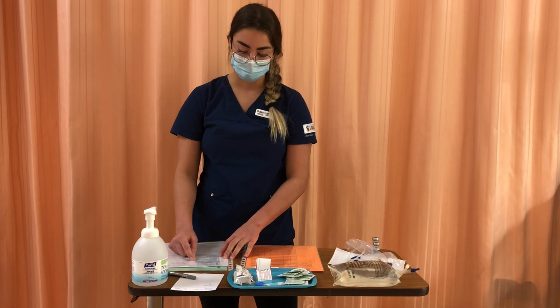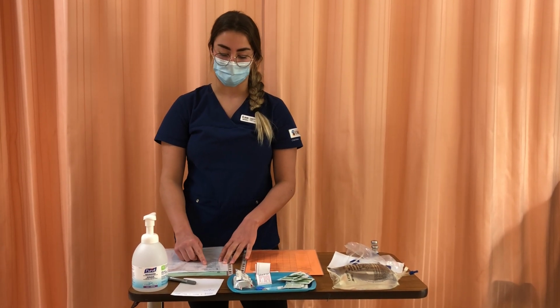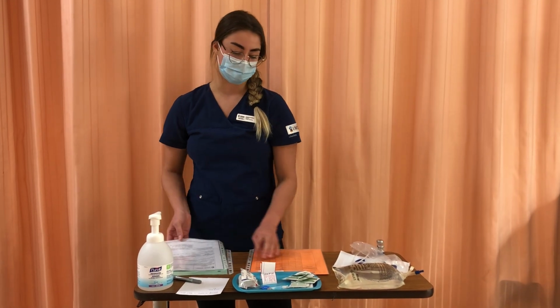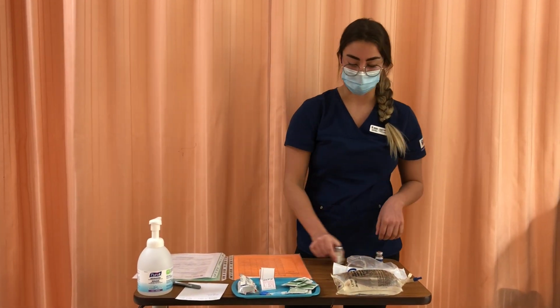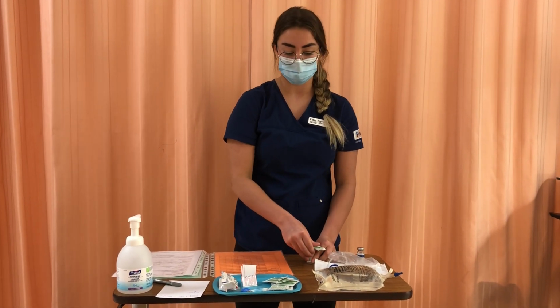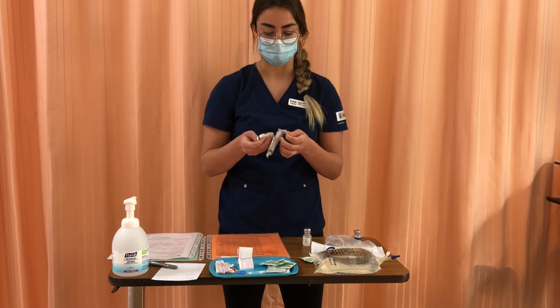And some hazards that I might mention to the patient are that they might experience a rash, nausea, vomiting, and diarrhea. So I'll make note of that, and then I'm ready to start preparing my medications. So I'm going to do hand hygiene again. Pull my sterile water here, and I'm going to swab the top for 30 seconds. Let it dry for 15 while I get my supplies ready.